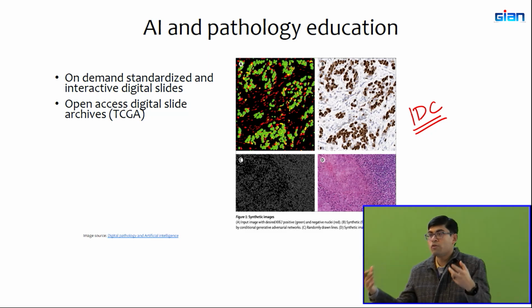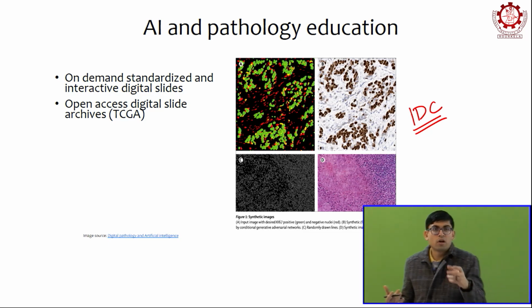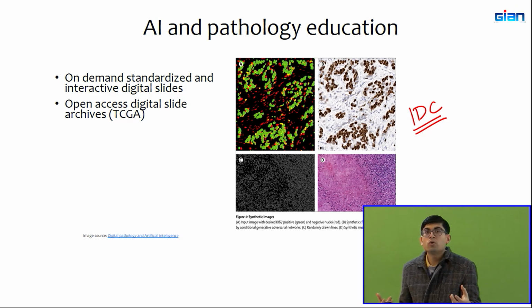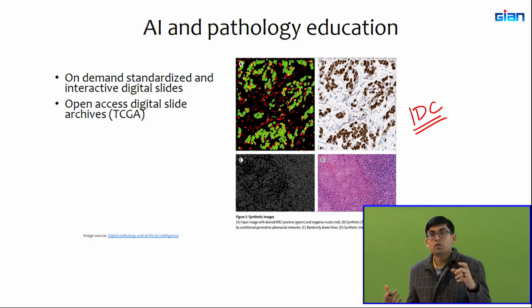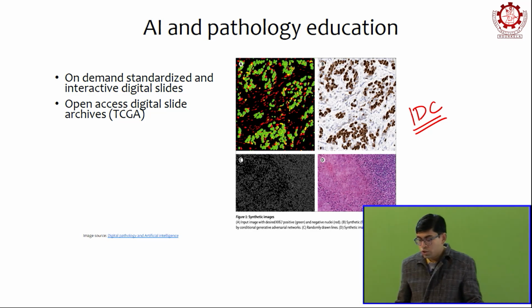Right? So let's say that you have developed a new algorithm for quantification of cells, or let's say you have developed a new algorithm, mostly for radiology, for blood vessel analysis, like we saw yesterday. You can always upload your code. You can talk to the IDC folks. They can help you integrate it, and you can pull images that you haven't analyzed yet, and you can run it on their platform. So this is a relatively new initiative. This, I think, is at Harvard. Yeah.